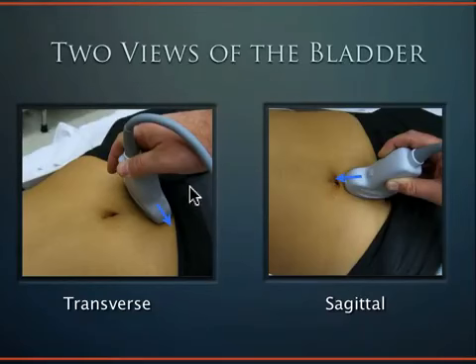But in all our patients we're doing this on, in our models today, they're not butt naked. So what happens is we end up putting the probe a little bit higher than where the bladder is. So to compensate for that, what we need to do is actually tilt the probe this way, sending the sound inferiorly down here, which is really where the bladder is. It's like all the way down by the pubic symphysis. That's how inferior or downtown the bladder is.